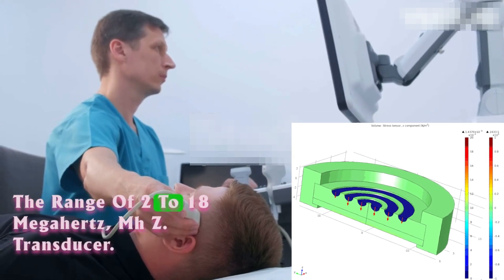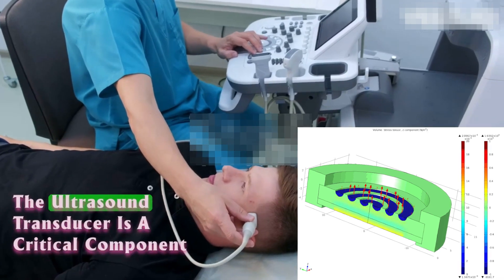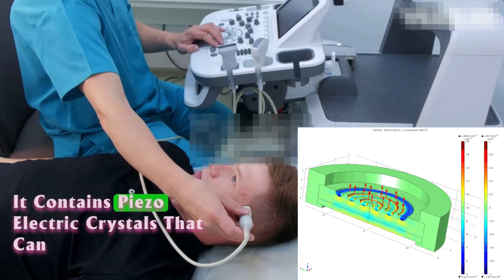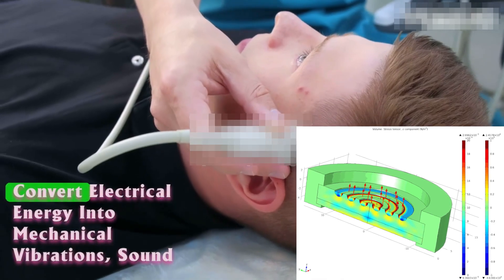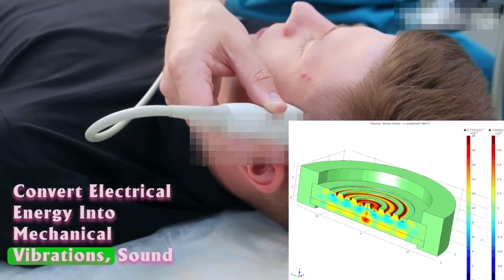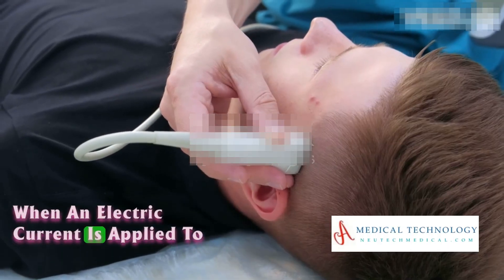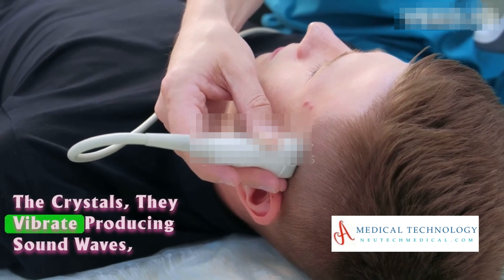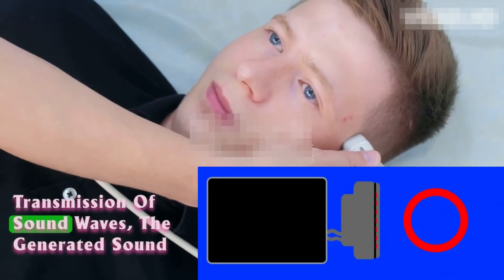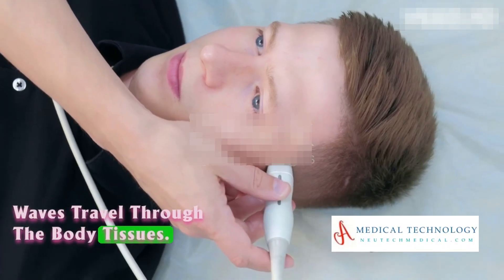The ultrasound transducer is a critical component. It contains piezoelectric crystals that can convert electrical energy into mechanical vibrations — sound waves — and vice versa. When an electric current is applied to the crystals, they vibrate, producing sound waves that travel through the body tissues.